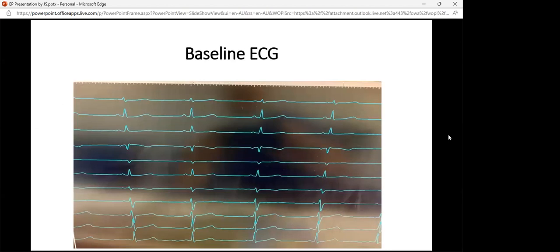Now, from the moment the patient walks into the cath lab, I'm always working on this rule in, rule out workflow pattern. Of all the things we just spoke about previously, I'm looking, all right, well, can it be this or can it not be that? So I'm always trying to rule things in, or more importantly, rule things out, because the more things we can rule out, the quicker we get to our diagnosis.